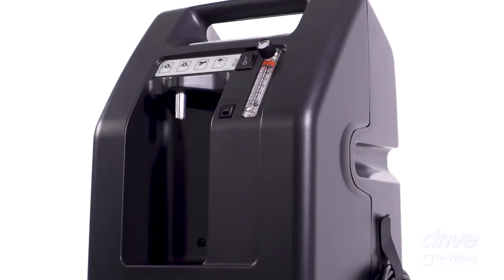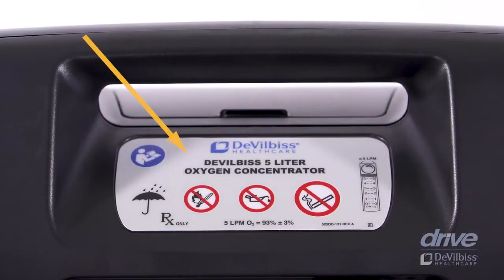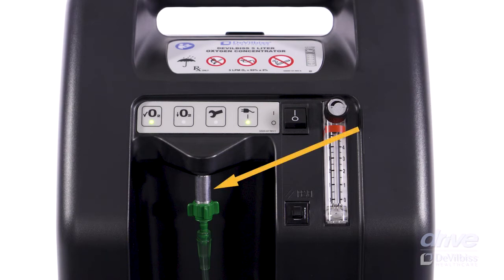Let's quickly review the main parts of your 5-liter Drive DeVilbiss 525 DS Oxygen Concentrator. Warning label. Green power light illuminates when your concentrator is operating properly. Power switch. Flow meter knob. Flow meter. Circuit breaker resets the unit after electrical overload shutdown. Oxygen outlet. Oxygen is dispersed through this port.